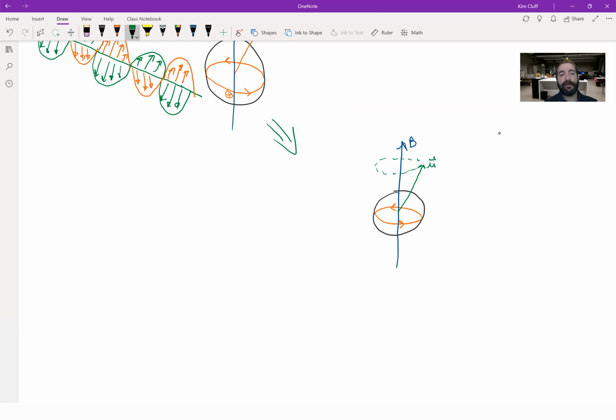Well, what happens when the frequency of the RF pulse matches the exact frequency of precession? It'll resonate and it'll absorb that energy, and it'll actually tilt the magnetic moment on its side like this, and cause it to precess about like this.